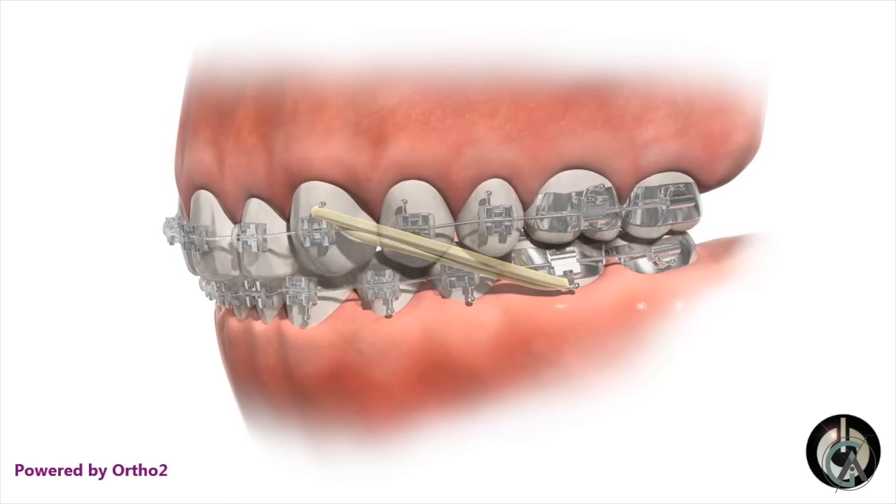If the overjet is minor enough, we can use class two elastics to correct this overjet. If it's a little bit more severe, or if you're not being cooperative with your elastics — and I'm talking to you, if you're not wearing your rubber bands and you're supposed to be wearing them right now, pause this video and put your rubber bands in so your orthodontist doesn't yell at you at your next visit. But if you're not being cooperative with your elastics, or if your overjet is a little bit too much, what your orthodontist might use is a Forces appliance, which is what we're going to talk about in today's video.